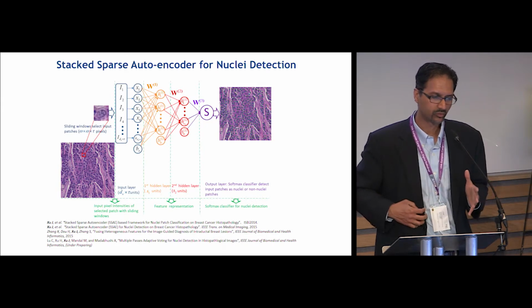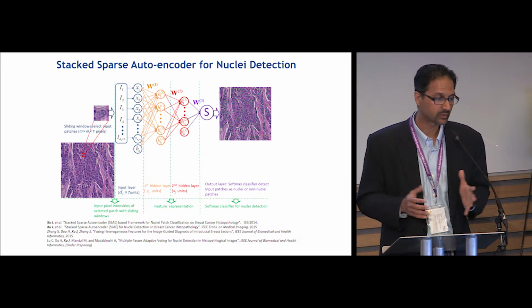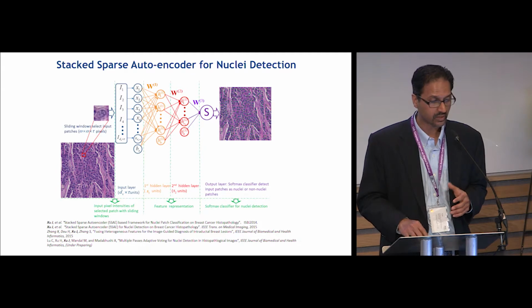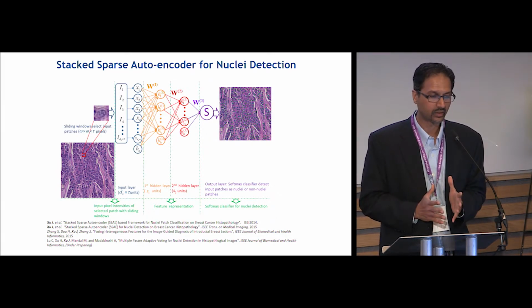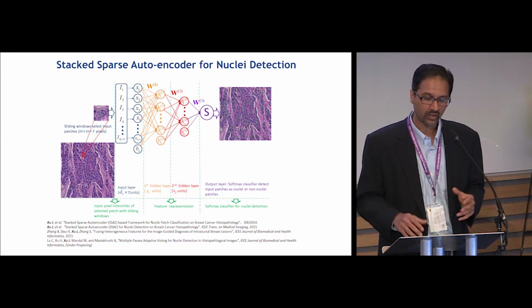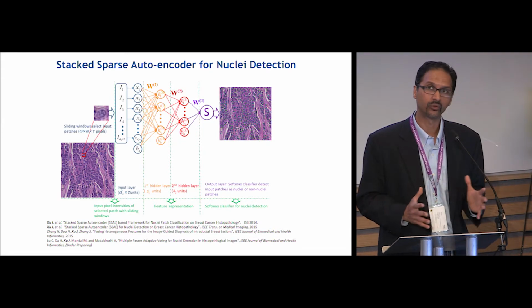I'm not going to go into a full-blown tutorial on deep learning. You're going to hear a lot about this from several excellent talks over the course of the 2 days. But the use of neural networks has really been a very, very exciting and powerful addition to the armory of computational pathology, right? So this has really been a game changer over the last 5 years.